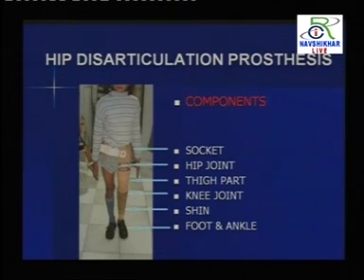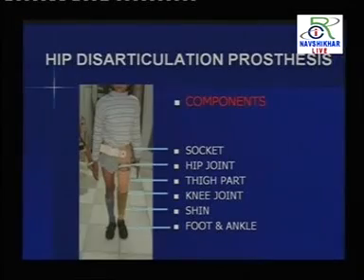All these components have been fitted. Again, the selection of the component is as per the requirement or the condition of the individual person. Because ये एक गांव से आई थी, तो इसको इस तरह का प्रोसेसिस देना हमने ठीक समझा जो इसके लिए मेंटेनेंस फ्री हो. अगर मेंटेनेंस की ज़रूरत भी पड़े तो इसको बार बार शहर में भागना ना पड़े. तो इसके अंदर कंपोनेंट्स भी इस तरह के इस्तेमाल किए गए हैं जो उसको कहीं भी रिपेयर करवा सकते हैं.